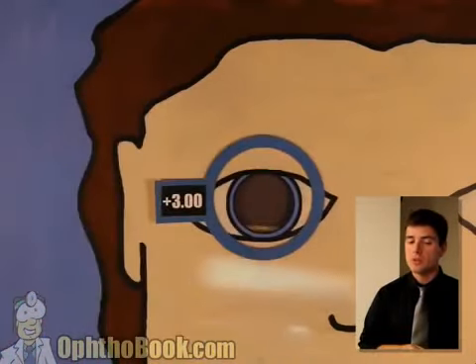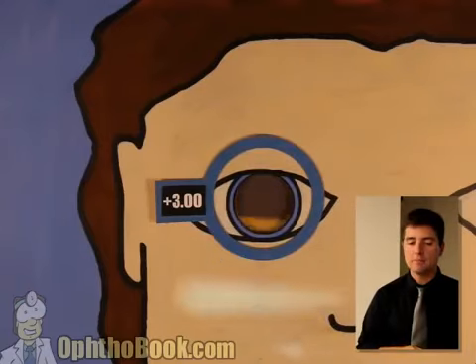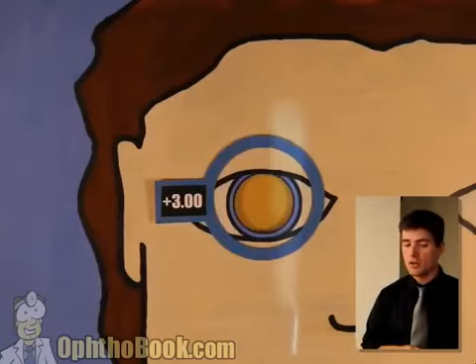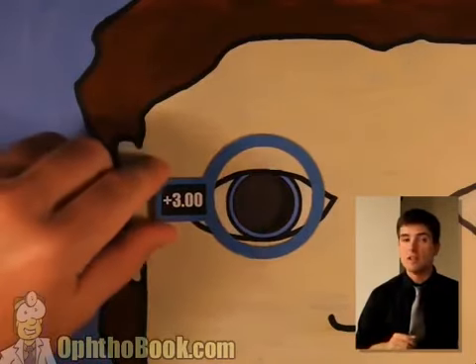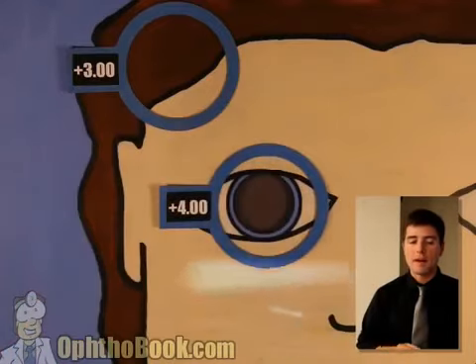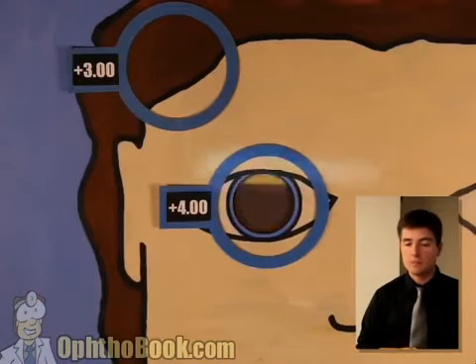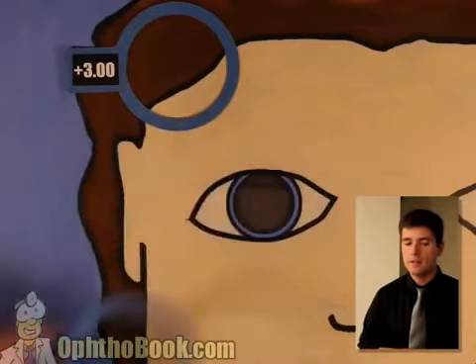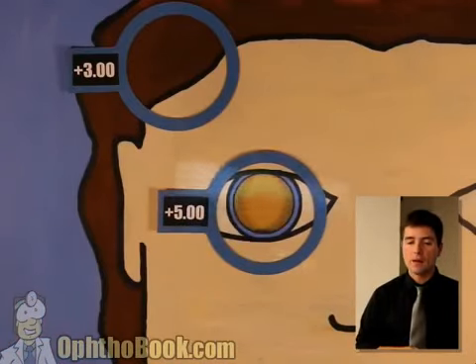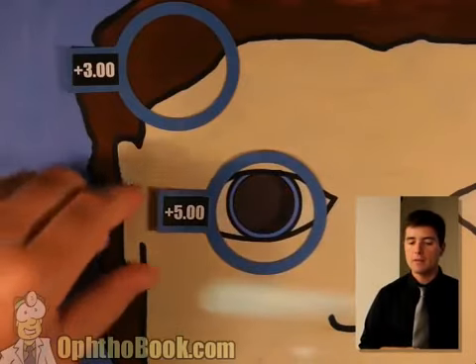So let's try this way. No, still need a lot more this way. However, this way, we've got it. This is the right prescription in this direction. Let's set this lens aside. Set it aside or you'll forget. Just set it aside. Keep adding power, and let's go back to the other direction until we fix that too. Still have width, not quite there yet. Let's try this +5 lens. Perfect. Now we have the right power for that meridian.